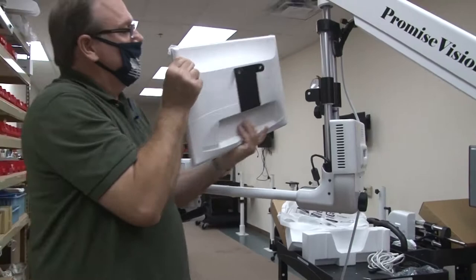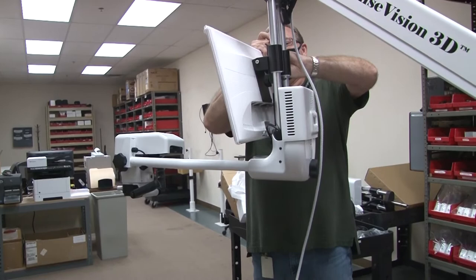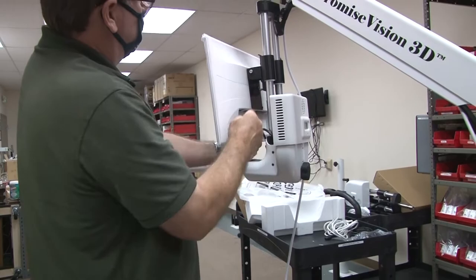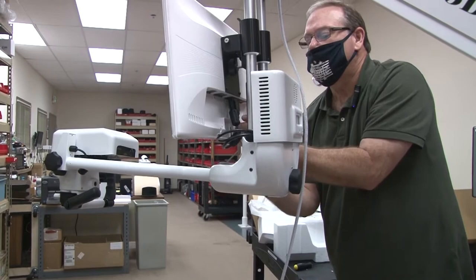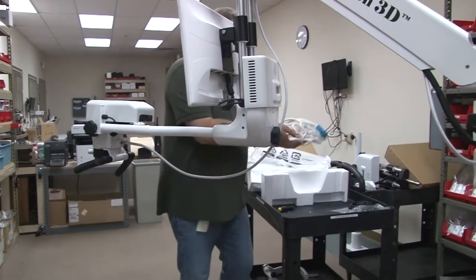Add the monitor — that is just the tilt of the monitor, and you want a little bit of tilt on it. Hook up your light guide, then plug in your power cable.